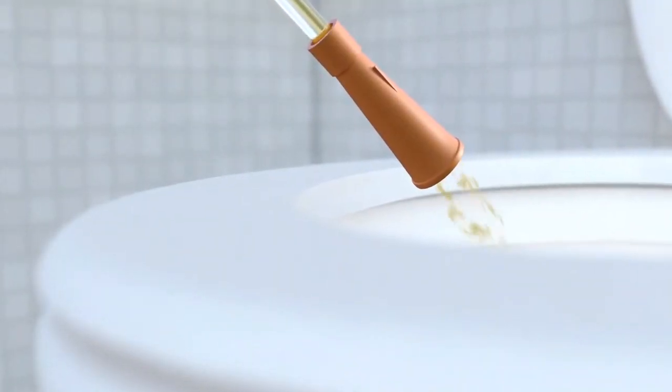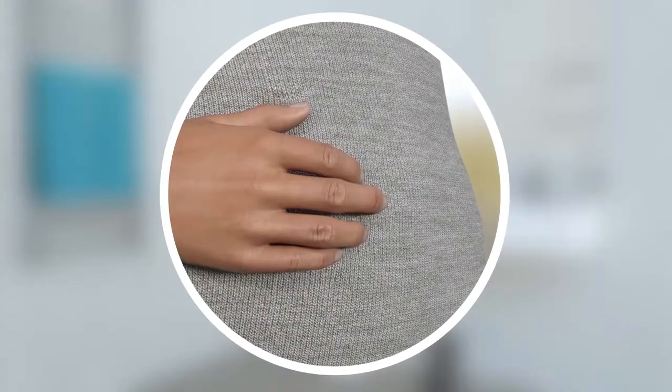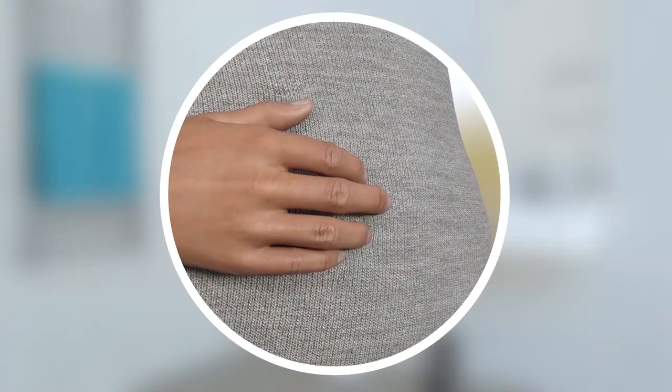That's the hard part done. Now simply let the urine flow out. To help push urine out of your bladder, you can try pressing on your abdomen with your free hand, or leaning forward.